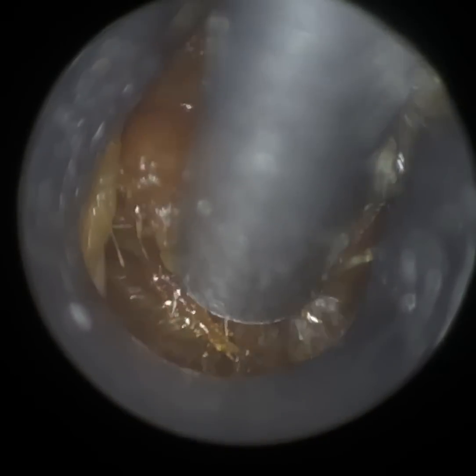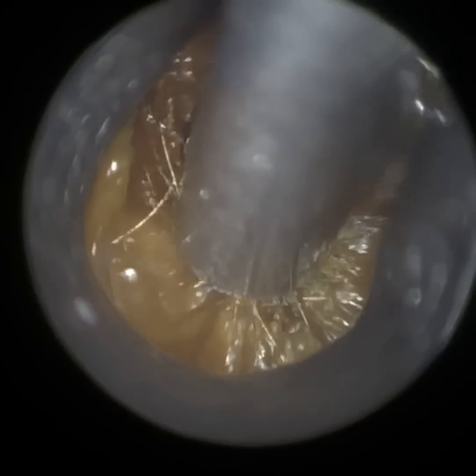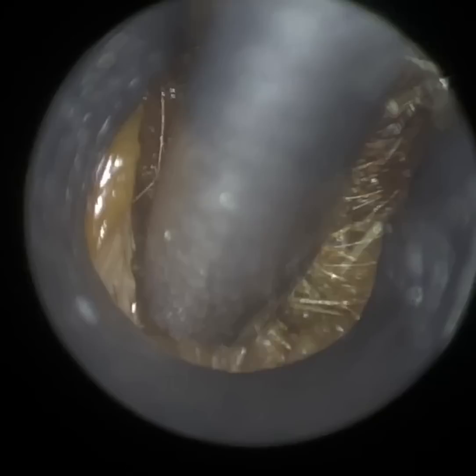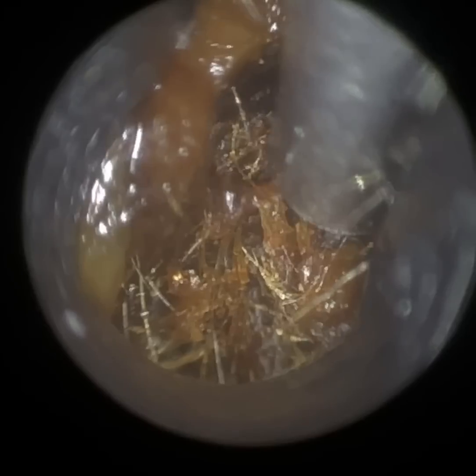We have here a very interesting case. We're commencing with the patient's left ear, but their right ear is really, really interesting. They've got this clay type of earwax — it's matted. They had been using drops for a while, and that can sometimes be counterproductive, because when you've got an impaction such as this, earwax drops will soften the wax, but it's not going to remove the wax.